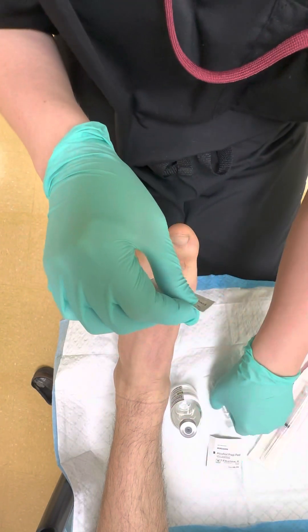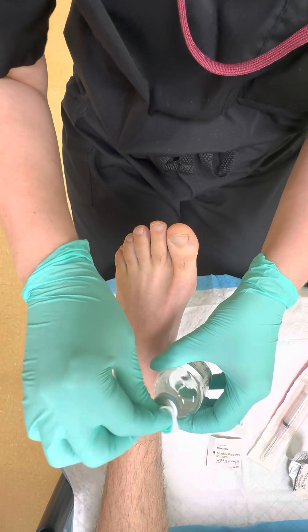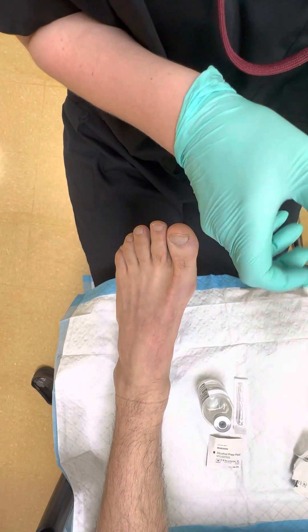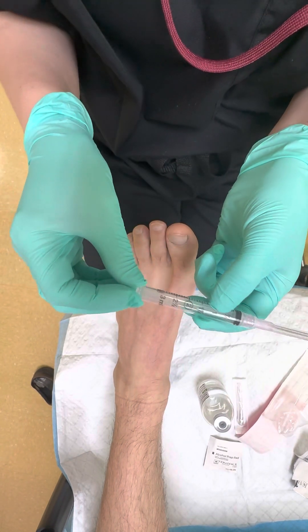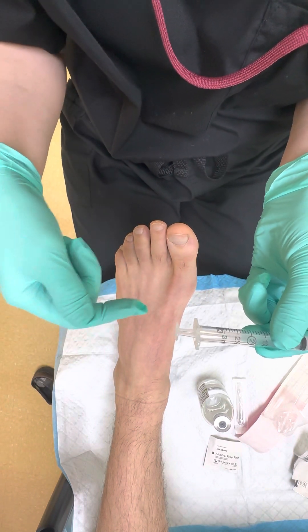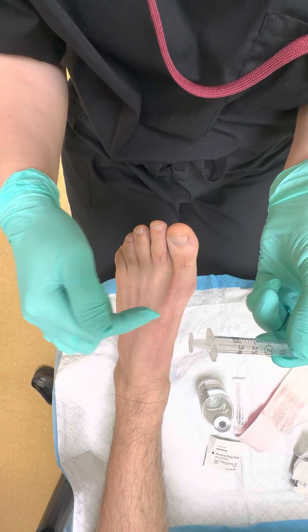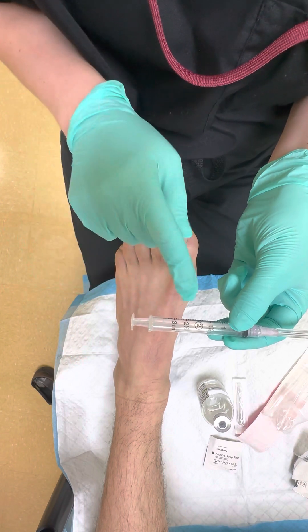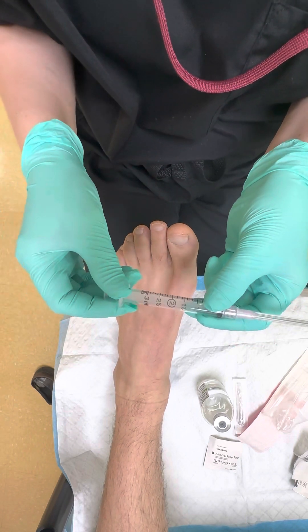Make sure the local is not expired. Take your alcohol prep pad and wipe the top of the bottle — even if there's a cap on it, even if it's a brand new bottle. Then get your 18 gauge drawing needle onto your syringe. This is a 3ml syringe, but we could do a 4ml injection — one milliliter for each nerve — because we want to anesthetize the dorsal proper digital nerves one and two, and plantar proper digital nerves one and two.